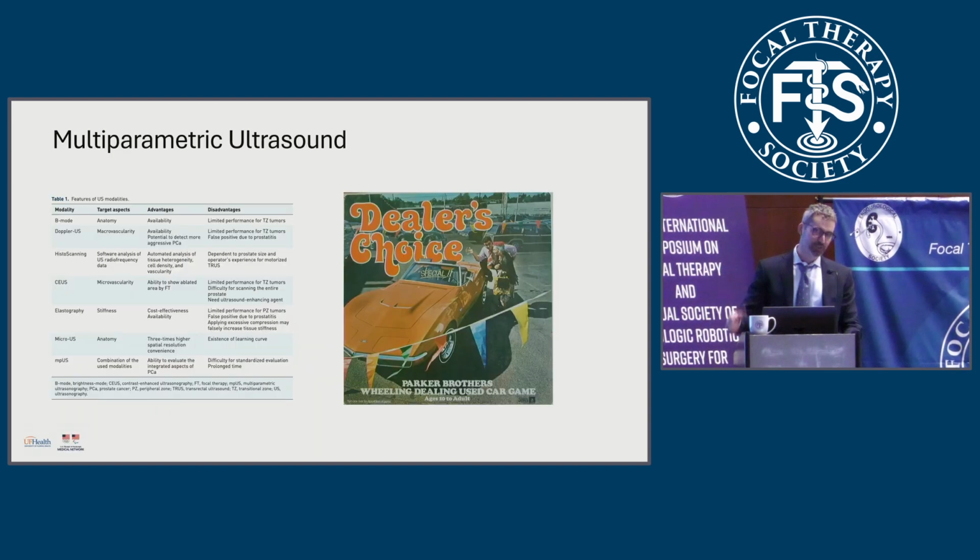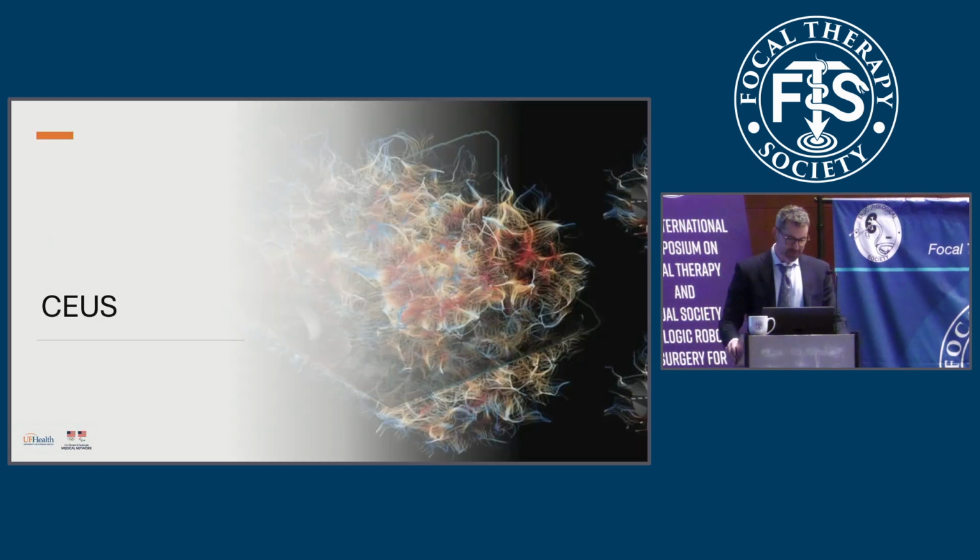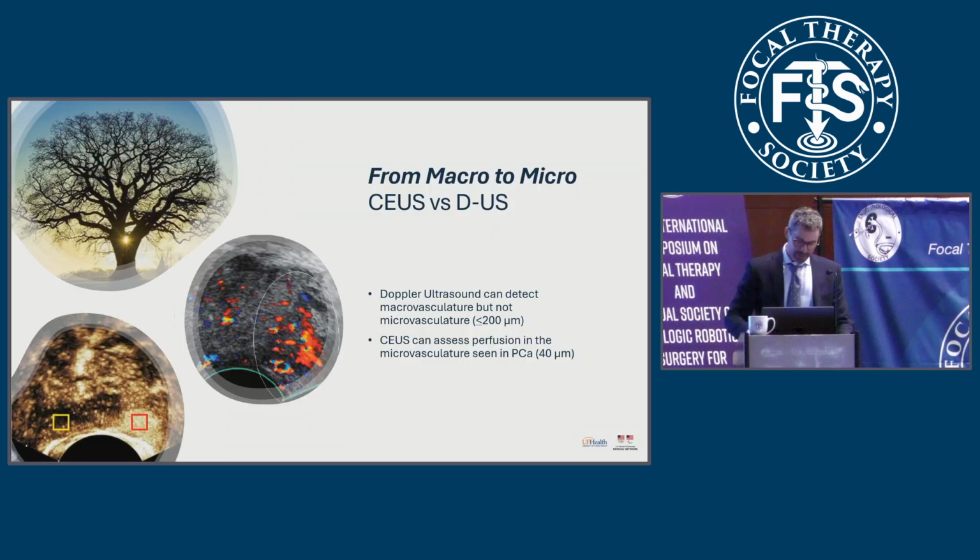Now, what is multiparametric ultrasound? Well, it's a dealer's choice of 3 of these modalities. You pick the 3 and you come up with your clinical endpoint. But for the purpose of this talk, I'd like to focus on contrast-enhanced ultrasound. Now, contrast-enhanced ultrasound, I took this picture of a tree because it's going from larger branches to the smaller ones.